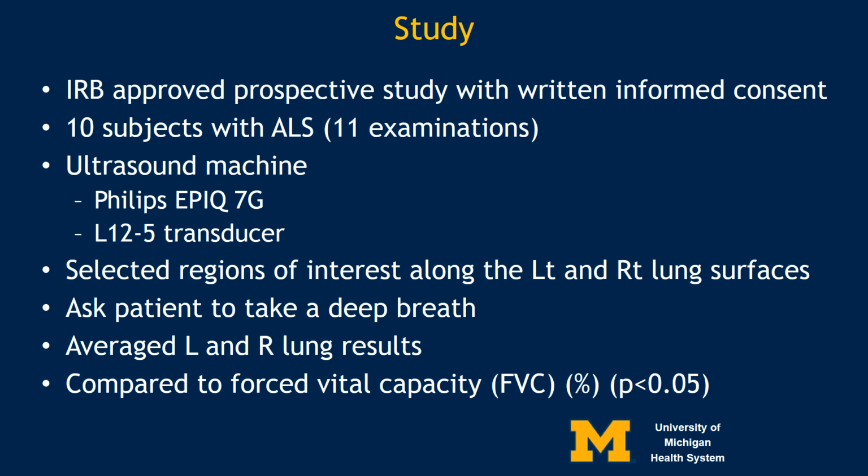We then compared these average results to the forced vital capacity, which is presented in percentage, based on the patient's age and body habitus. The evaluations were made based on a p-value of 0.05.